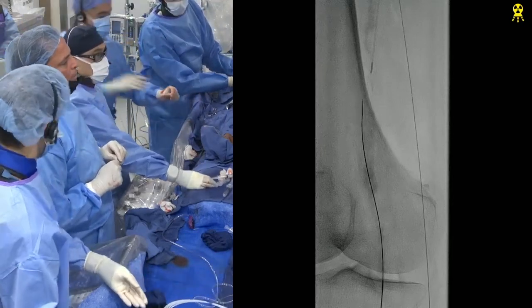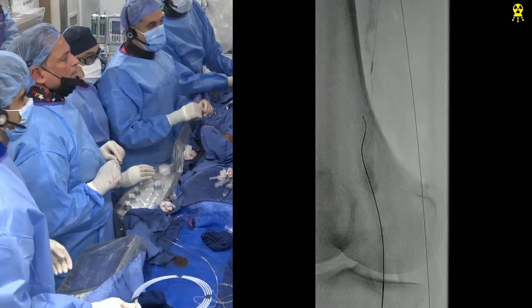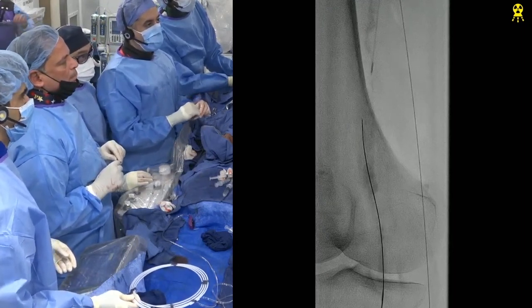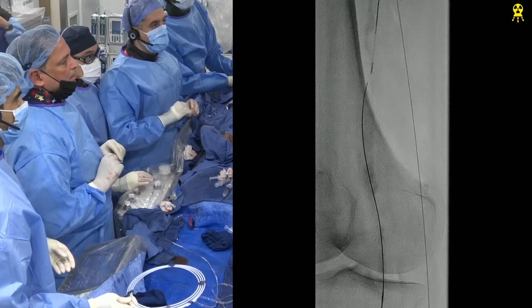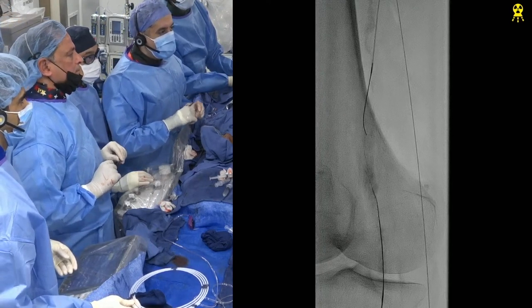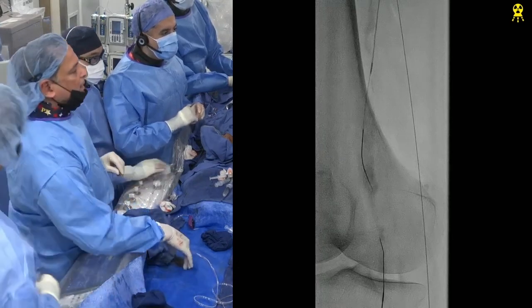PK, they cross from above. If you take an 035 catheter from below, you're probably better off re-entering from below. I mean, getting into the catheter in the pop area. That would be ideal, yeah. Let them come, because they look like they're really free there. So I agree. Oh, I totally agree. They should come. I was just trying from there.